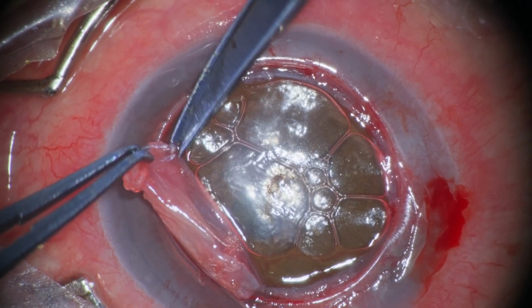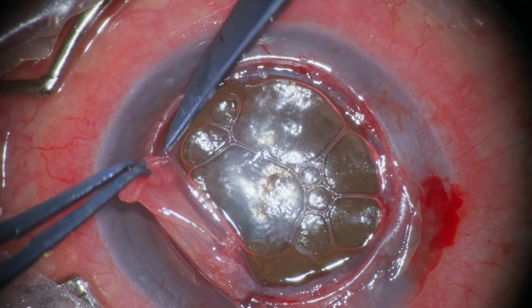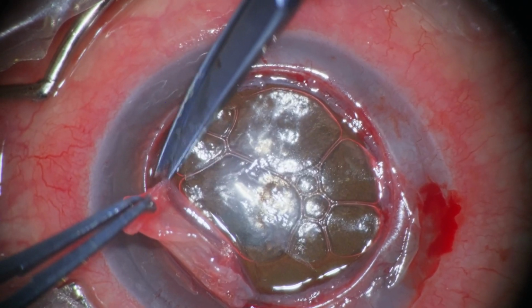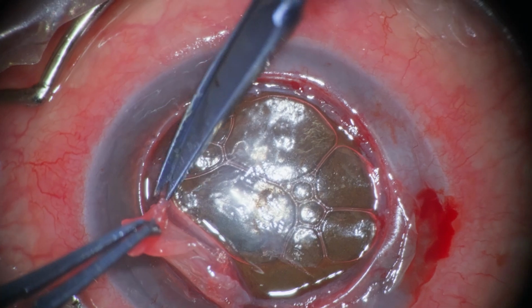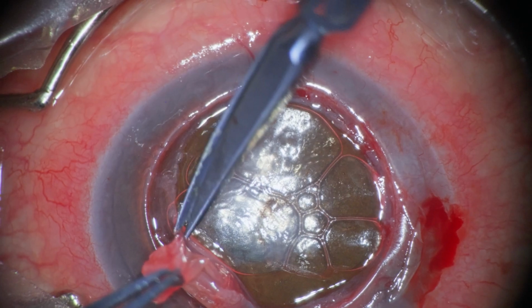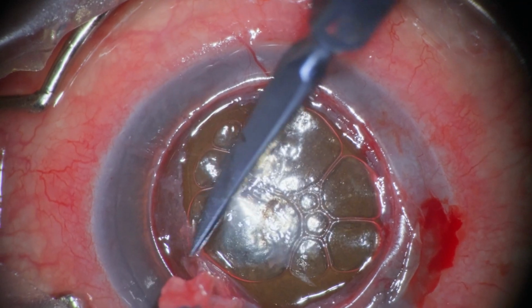We created this microperforation, which will prove significant in the post-op period because this patient in particular will have a double AC for about 3 weeks until it attaches. We've done about 3 rebubblings for her, but now she's completely attached.